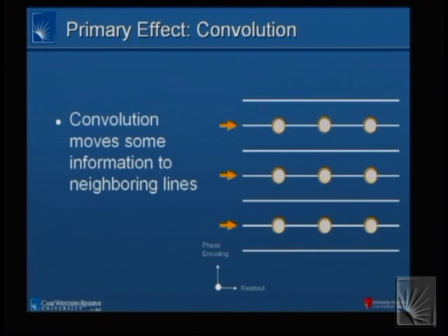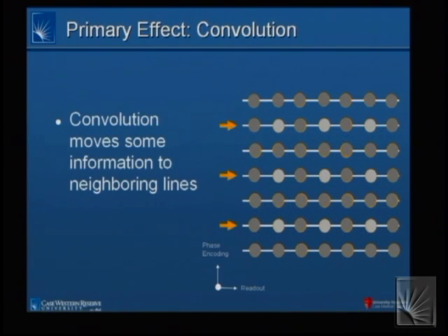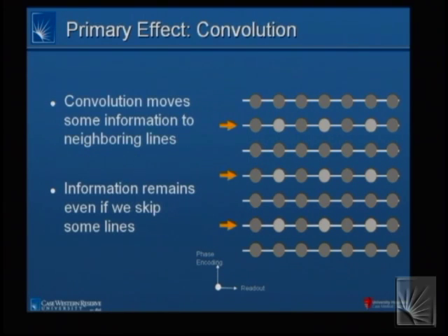Now, I'm going to sort of blast through this, but the neat thing is those coils essentially create a convolution in K-space. That is a smearing of information from one location to the next. Okay? So our challenge then is how to extract from that information what that coil information is.